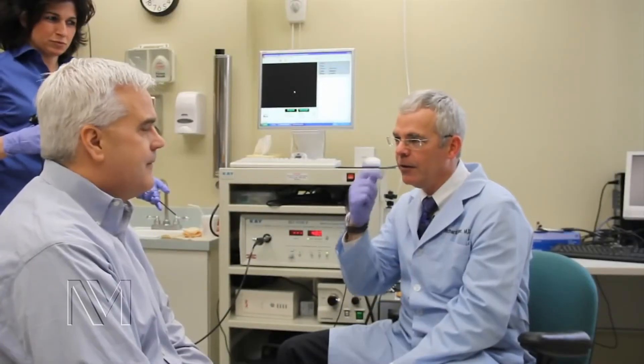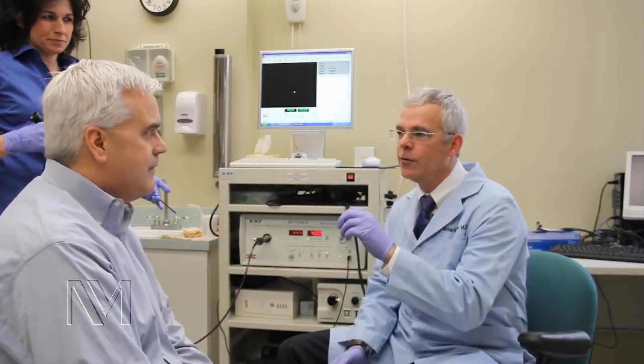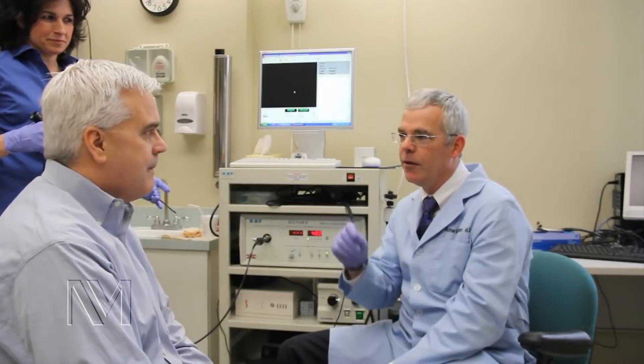John, we're going to do this FEES test today, which involves taking a camera and going down your nostril to look at your vocal cords and your swallow. I've numbed your nose up already so it's not too uncomfortable, and we'll be there about 10 or 15 minutes. Do you have any questions? No. Let's go.